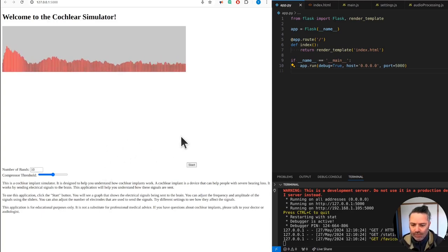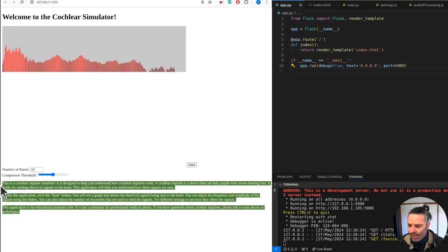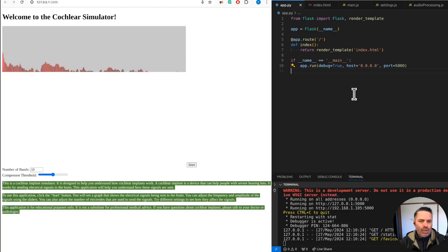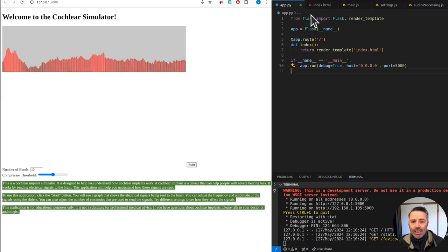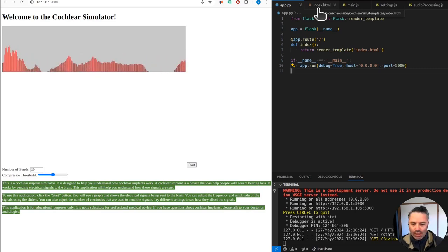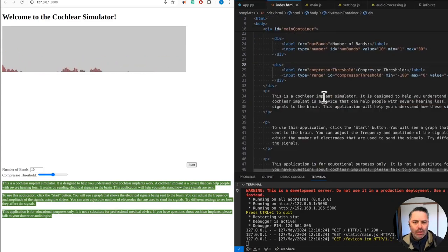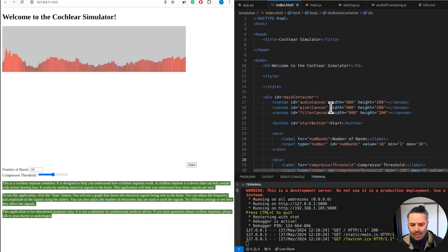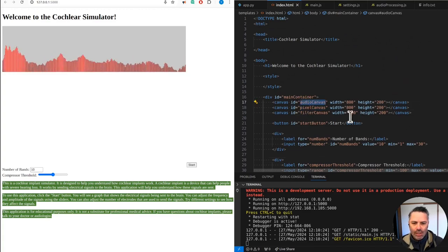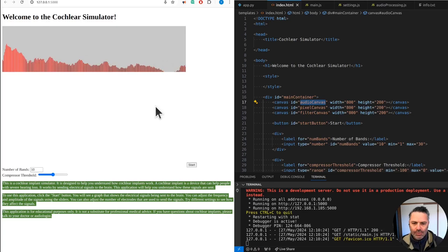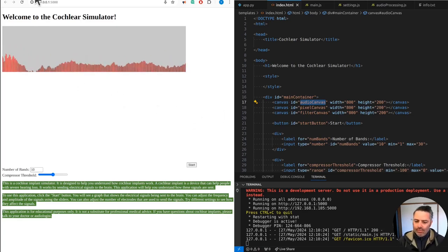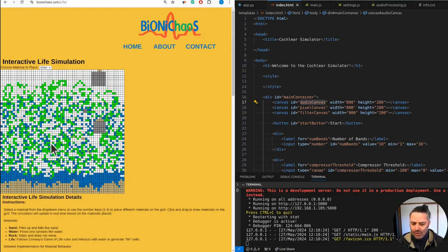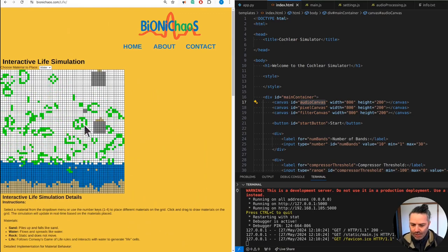This is only running locally at the moment, not published yet. I don't think it's ready because it's not doing much, but the idea is to have a cochlear implant simulator. We have the code, it's a Flask application. We want to do as little as possible in the backend, primarily rely on JavaScript. We have the index HTML and we're meant to have the audio canvas. Then we should also have a pixel canvas.